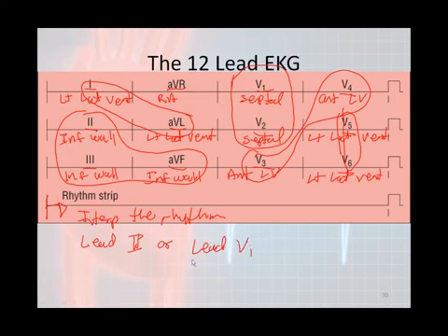Now, the reason that it has been lead V1 is because in the past, before we had 12 leads everywhere, they were only located pretty much in the hospitals, and they weren't really located much other places. What they would do is print up a rhythm strip using only leads 1, 2, and 3. And then if we wanted to see why we had a wide QRS, we could determine a bundle branch block or ventricular tachycardia using lead V1.